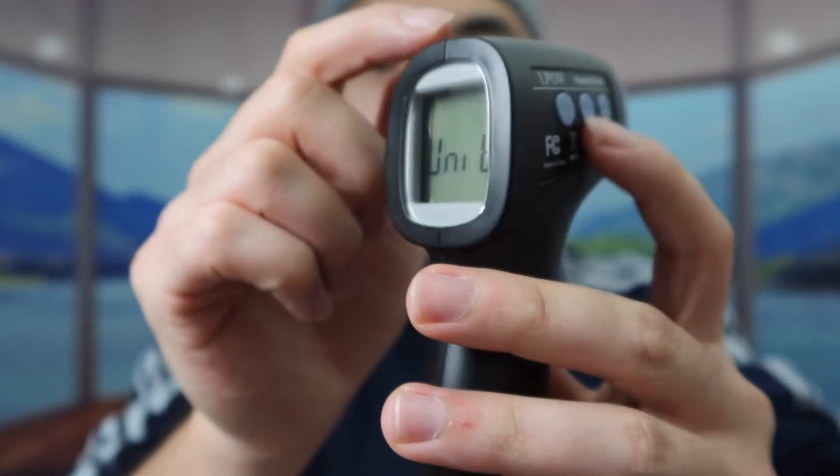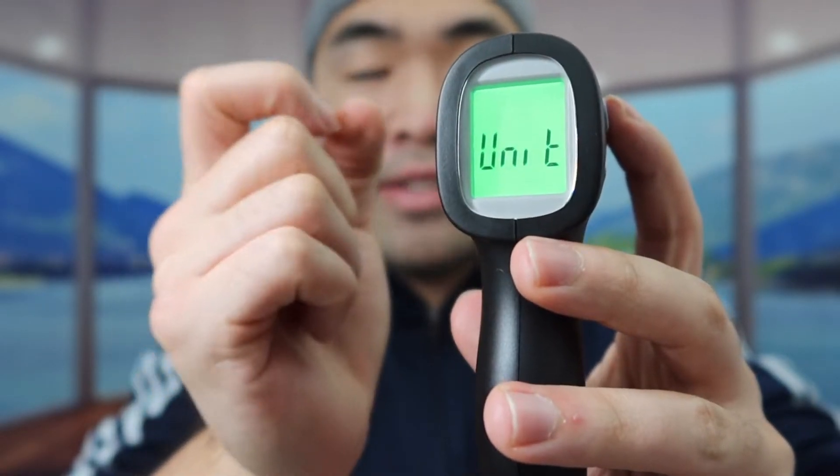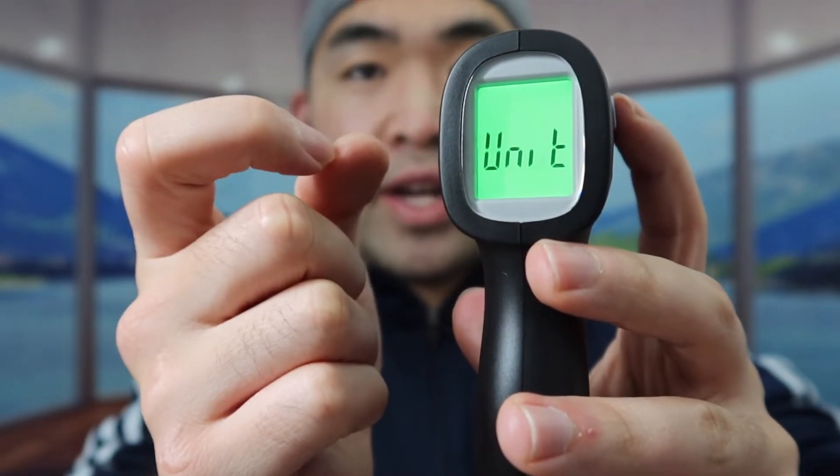Alright, so once you get to that screen, you basically want to press these two buttons. When you see it changed to Celsius — if you want to change it back, press again and now it's at Fahrenheit. So it's very easy and simple to change the unit, and it's really cool how it gives you fast results when you use it as well.